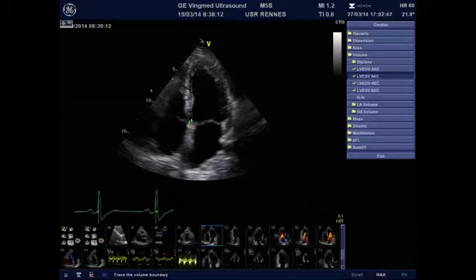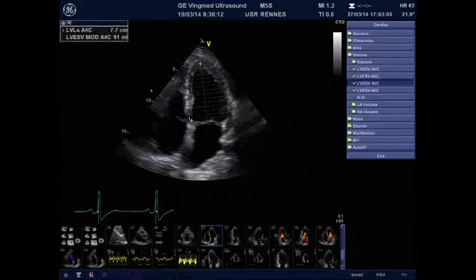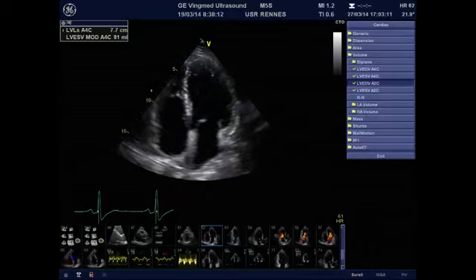I exclude the trabeculation and the papillary muscle to optimize the LV dimension, because we know that when we use the 2D echo techniques, we usually underestimate the LV volume as compared to the MRI. So I do my best to get the best delineation of the LV contours in end systole and in end diastole.